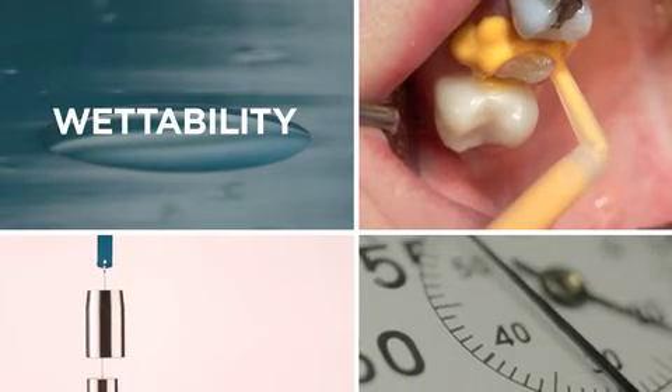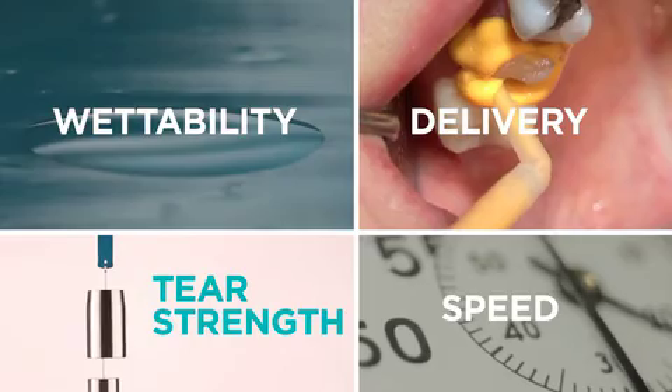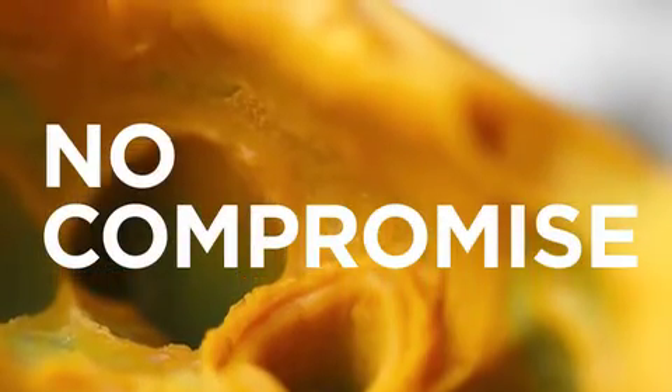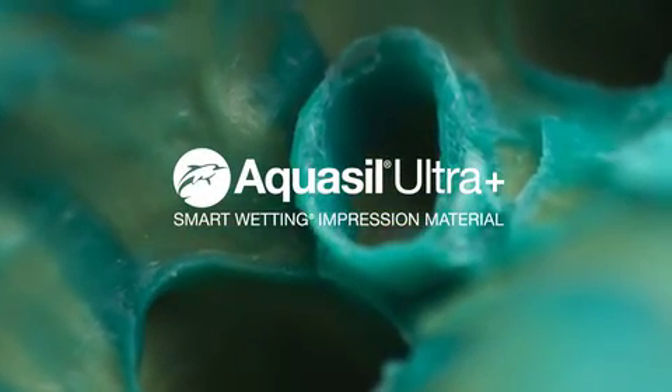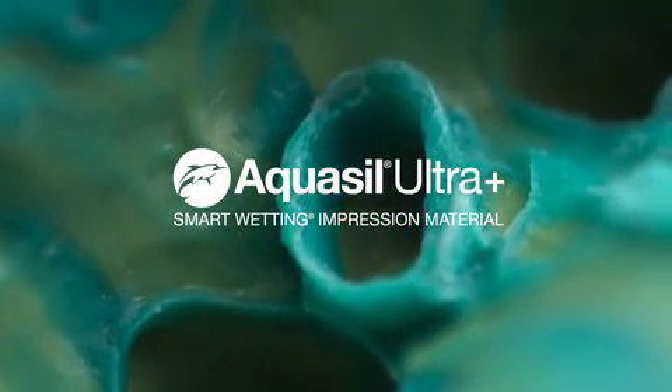You don't have to choose between wettability, tear strength, speed and delivery options. Experience the next evolution of impression material. Introducing Aquasil Ultra Plus.